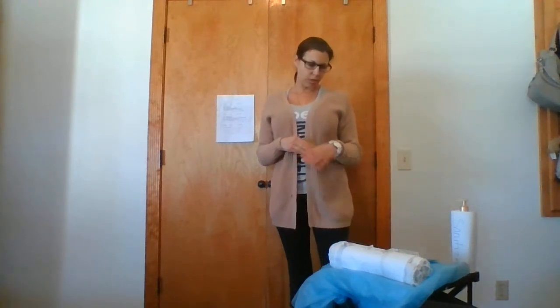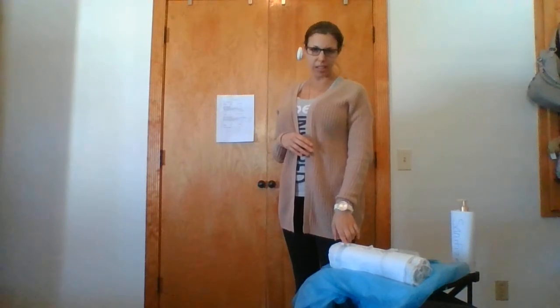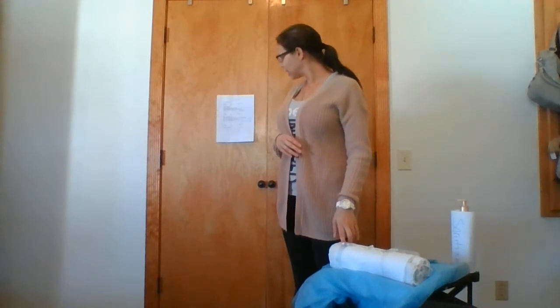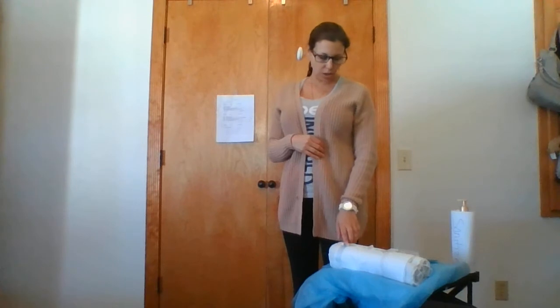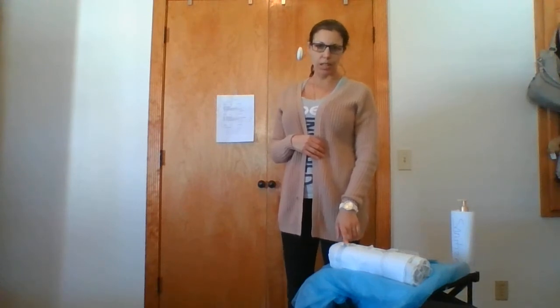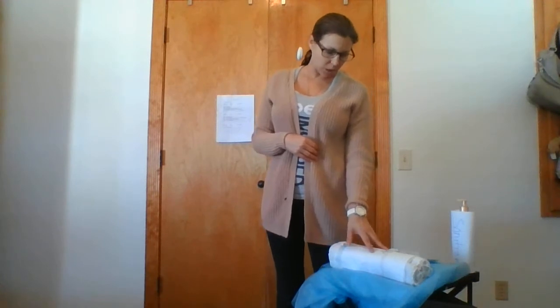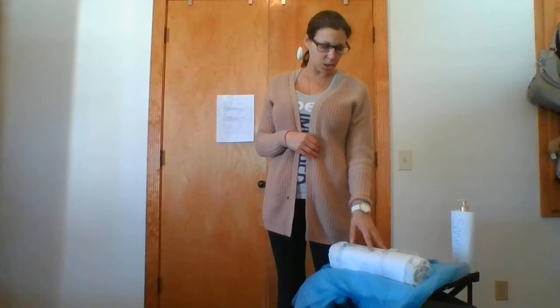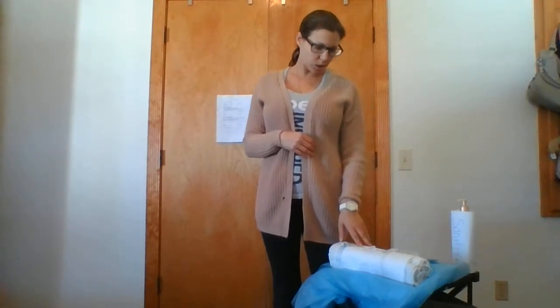I'm going to verify the band, make sure that it's Ellen Davis and her date of birth says 9/19/1963 with no known allergies. I'm also going to ask her to verbalize her name, date of birth, and that she has no allergies. While I'm doing that, I'll check the IV site, make sure there's no redness, inflammation, signs of infection, or edema to the area showing infiltration.